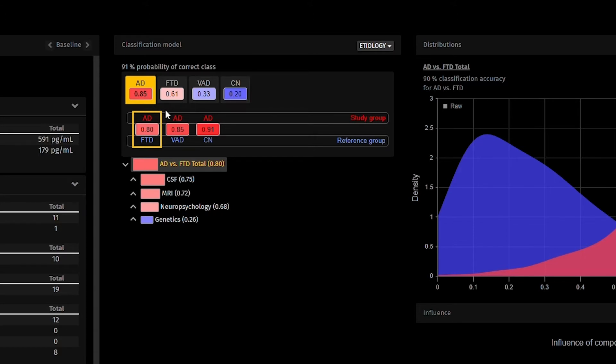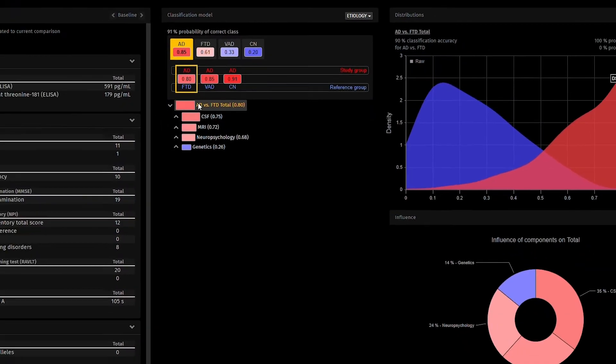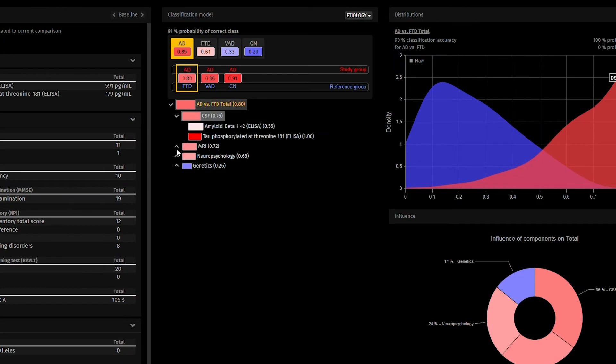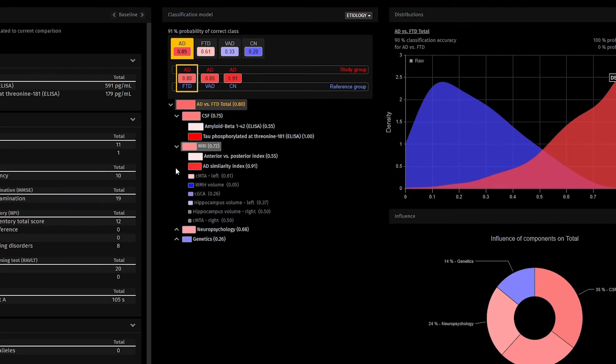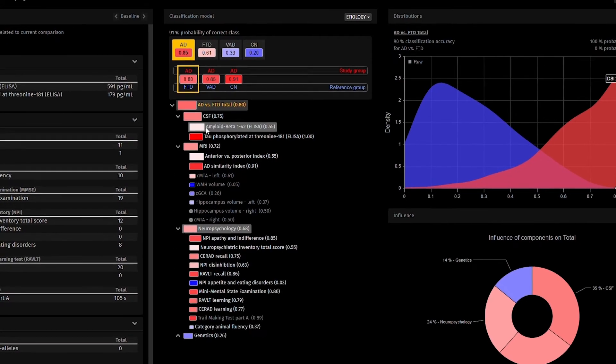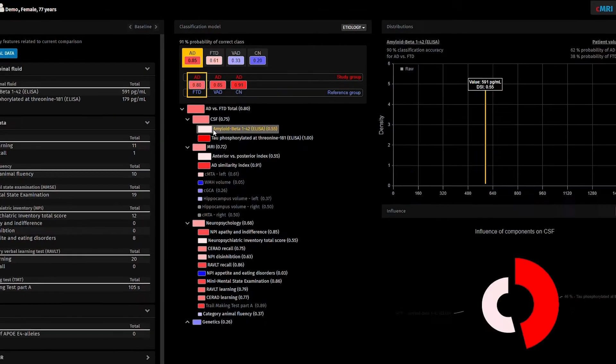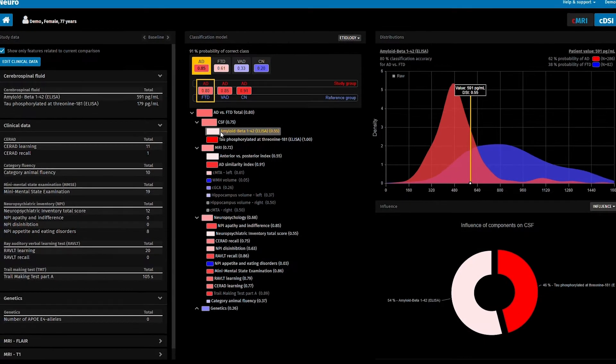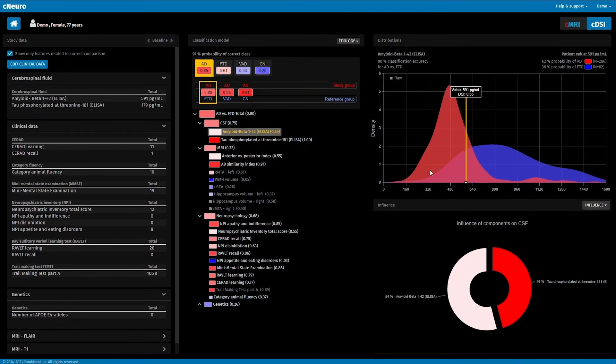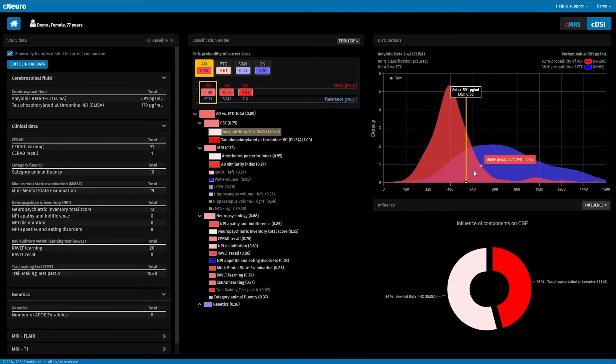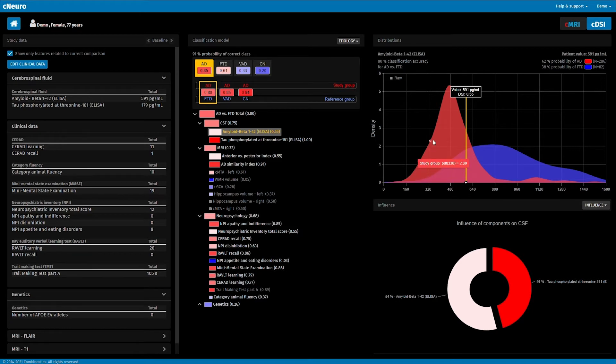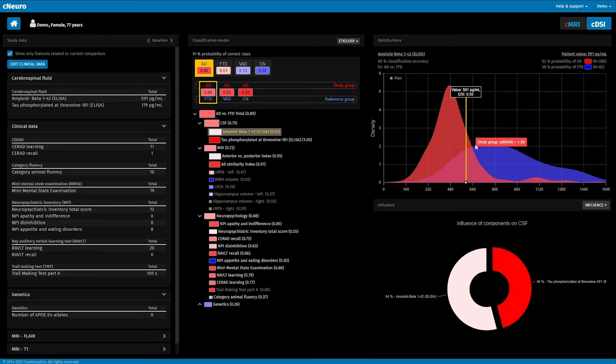The system then contrasts AD in red versus FTD in blue, and results are presented in this disease state fingerprint. If we click the box AB42 in CSF, we see the patient's value as the yellow line compared to the distributions of all previous AD cases in red and all previous FTD cases in blue.